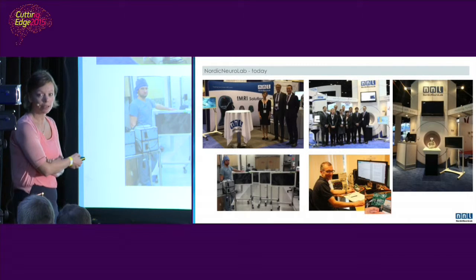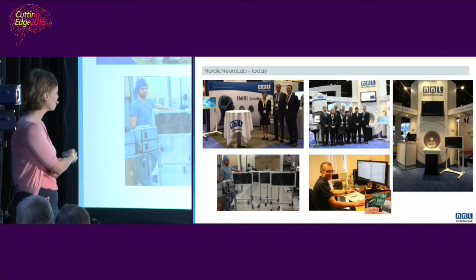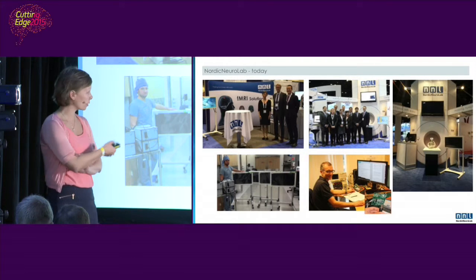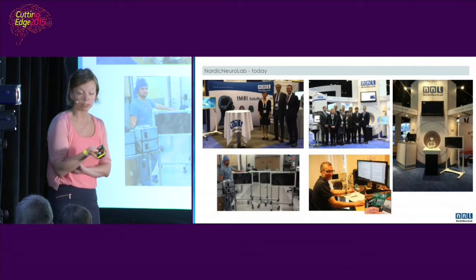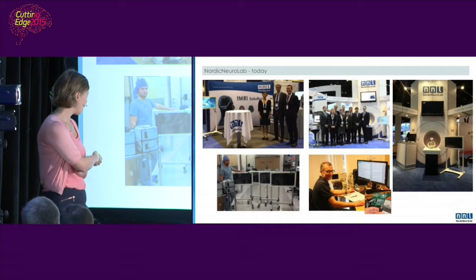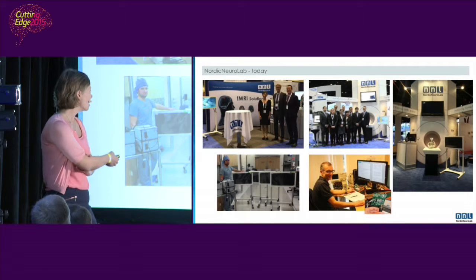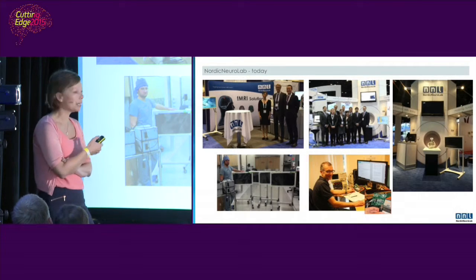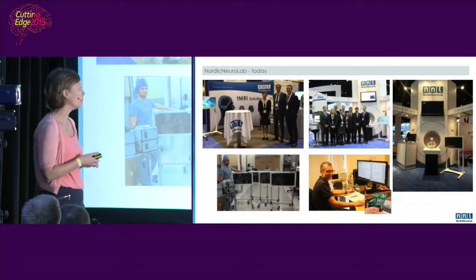We're also very active with customers. This is my colleague Anthony in the US office. He's doing an installation of 4 of these MR-compatible LCDs to a hospital, one of the most advanced hospitals in the world, which is the Brigham and Women's Hospital in Boston. They have, I think, almost 30 MR scanners on their campus, and this is used for MR intervention, which is combining surgery and MRI in the same room.